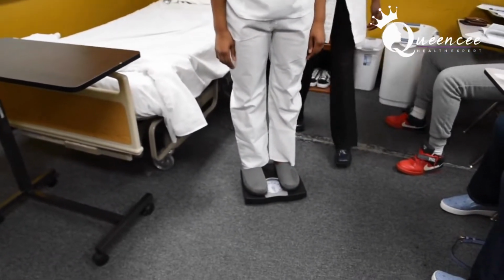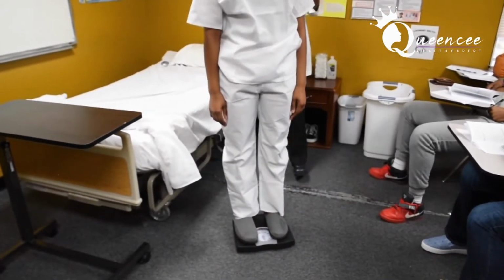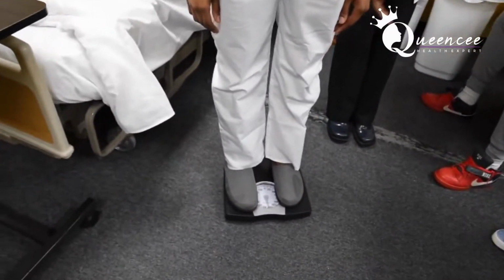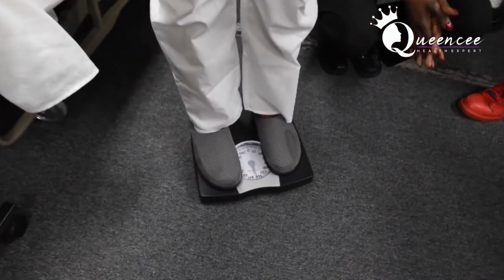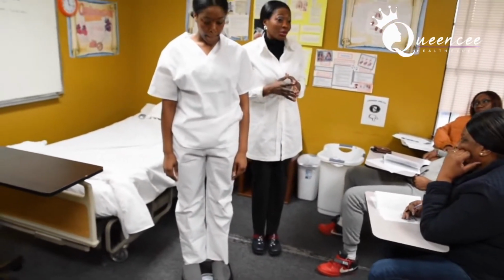Good. Once your client or your patient is on the scale, you're gonna let go. The examiner is also gonna come from her seat or his seat. Some of the examiners are male, and watch or look at the scale with you. All right, so I'm gonna squat here. Do not bend here. Remember, you have only 2 pounds as a margin of error.